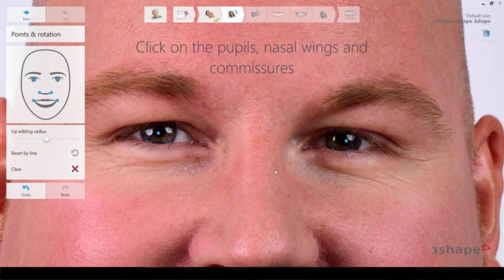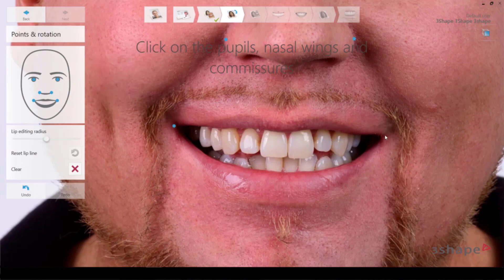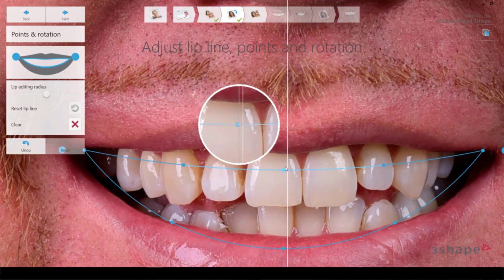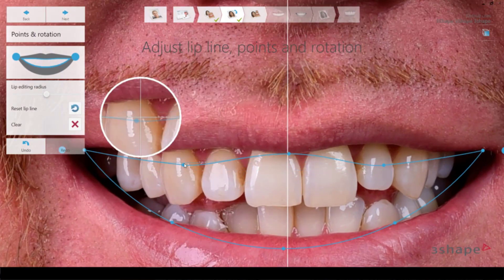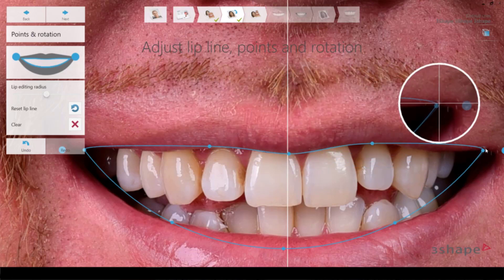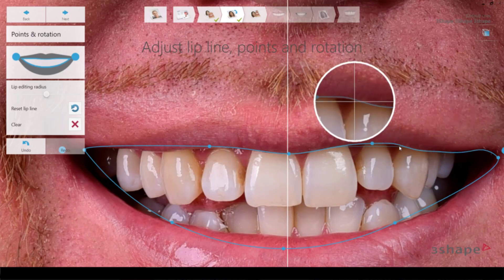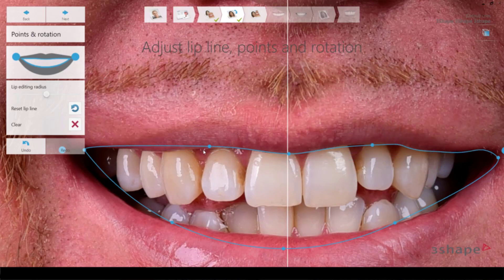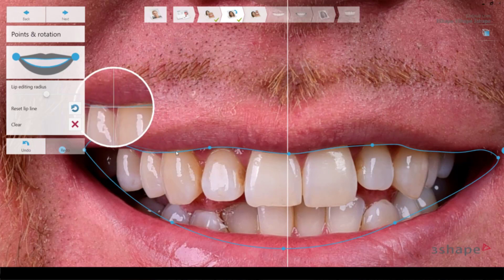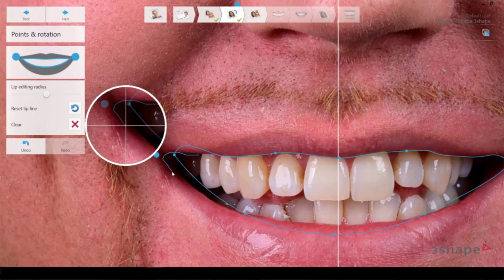We find the pupils, the nasal wings, and the commissures. Now the software straightens the pictures up and we have to find the lip line as well, so the software knows what's lip and what's teeth — especially on this patient where the lips are very close to or even over the teeth. The more time you spend here, the better result you will get at the end, because the shadowing from the lip will look so much better.